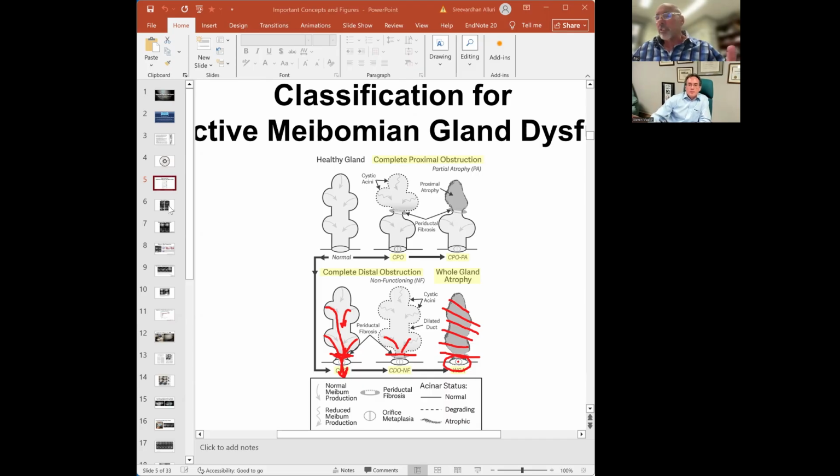There's not a piece of hardened meibum or something inside the gland that's clogging these. It's outside strangling them. So the scar tissue chokes off the flow, so there's trapped meibum behind the scar tissue. And so it's important to release that scar tissue.